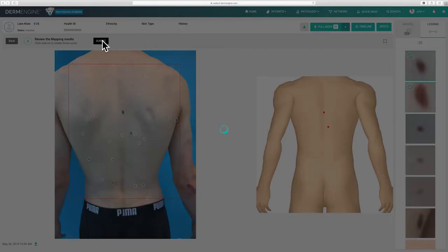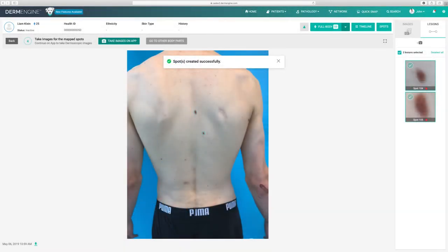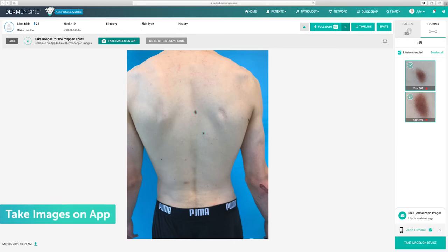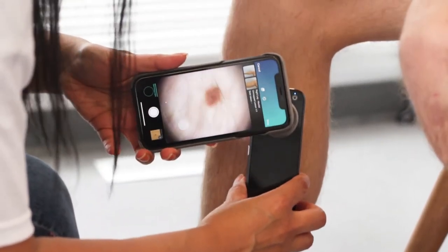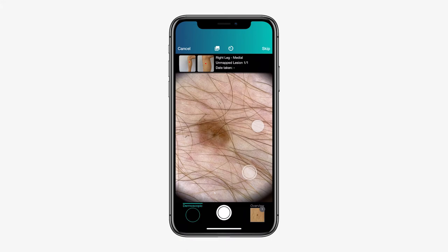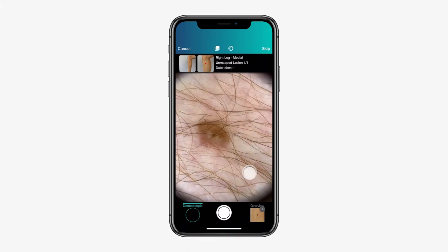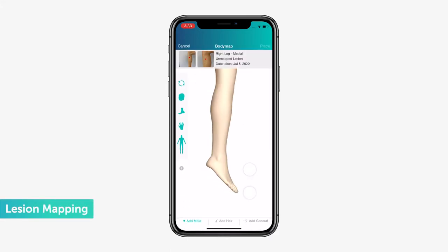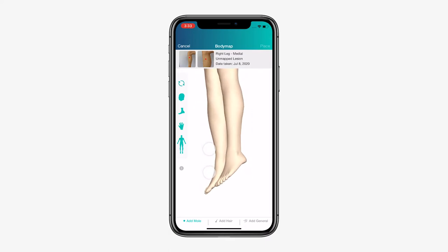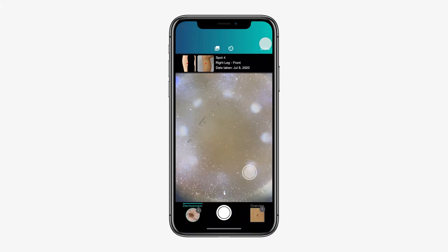Once you're finished mapping a patient's lesions, you have the ability to capture and associate dermoscopic images with a spot. Select take images on app, select your device, and confirm by pressing take images on device. Attach your dermoscope and take your dermoscopic images. You can take multiple dermoscopic images by simply hitting the camera button. In the bottom left corner, you can see how many dermoscopic images you've already taken. If you haven't already, map the spot to the patient's body map. To help ensure accurate placement, it's recommended that you use images of the patient's body part found in the top row as a point of reference. Once added, tap place. From here, you have the ability to take dermoscopic images or simply tap done when complete.